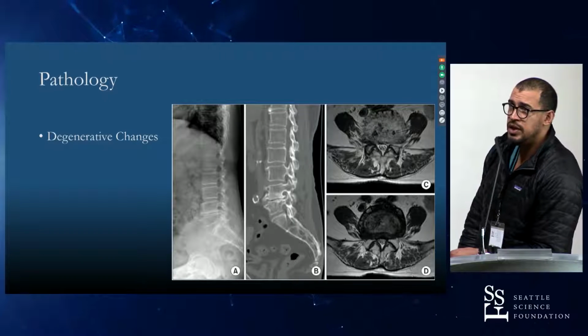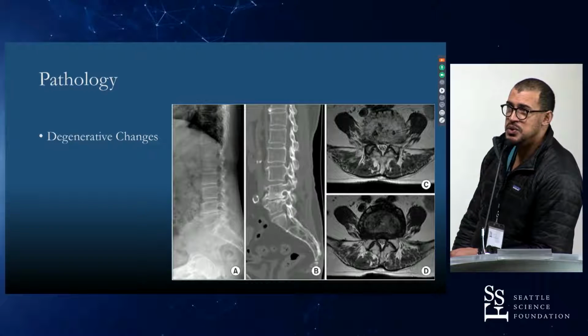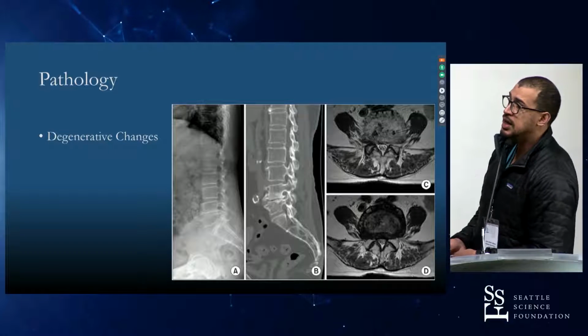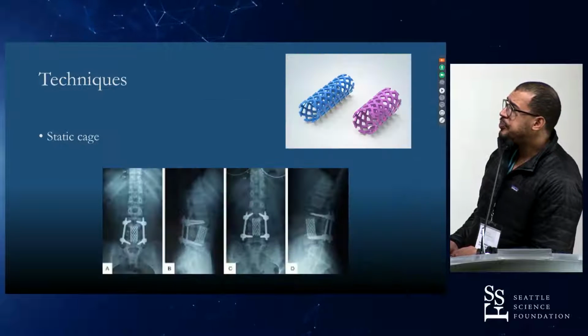So know that you may need to use a little bit more aggressive approach in conjunction, or you may not get all those results. You really want to look at the imaging intraoperatively to see how much you're actually getting.